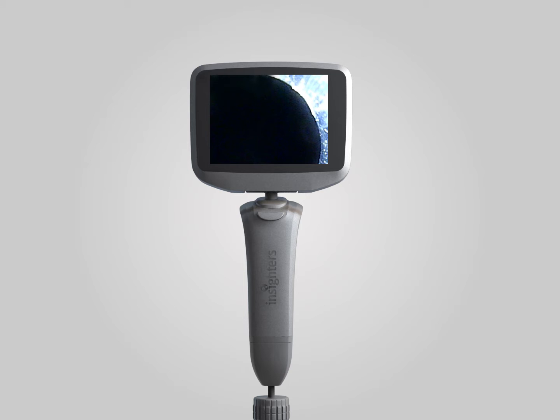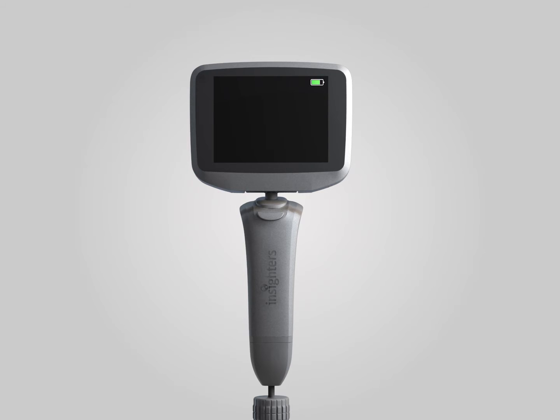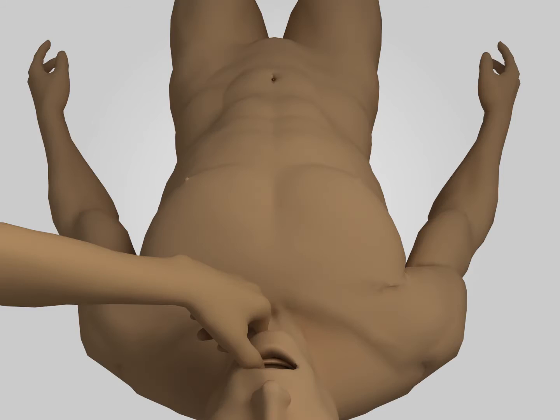Connect the main unit and turn on. The front end of the endotracheal tube should be seen in the monitor. Please note to check battery power at the same time. The operator shall stand on the cranial side of the patient with the video rigid laryngoscope in the right hand.